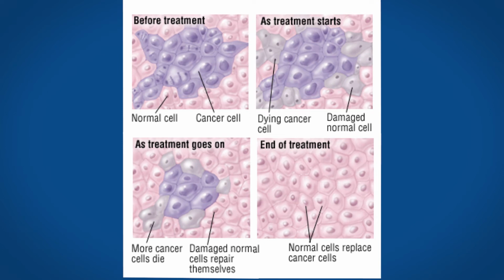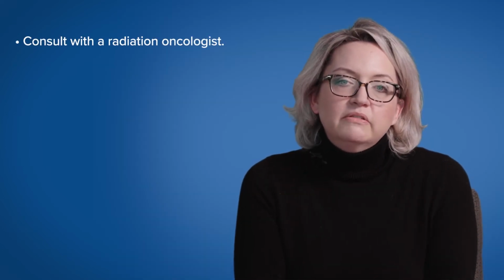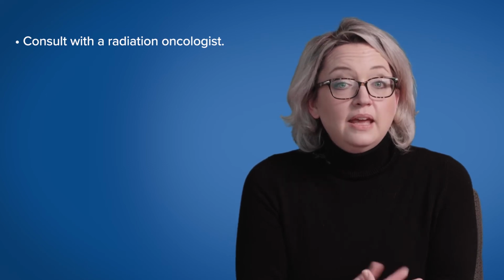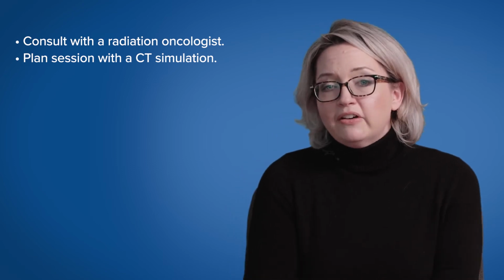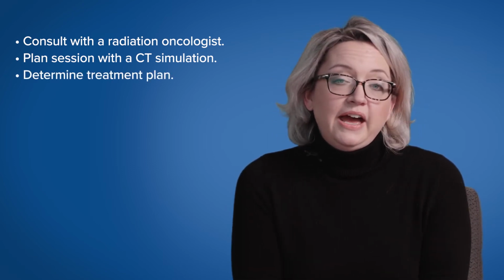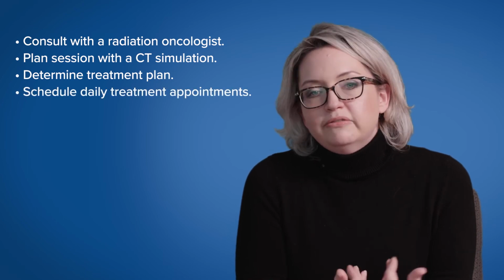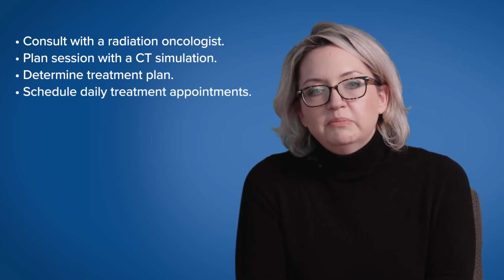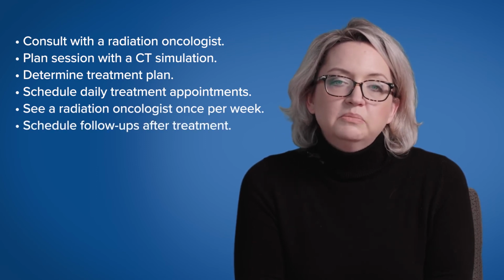If you're watching this video, you most likely have already met with one of our radiation oncologists, and they may have said that radiation therapy is appropriate for you. Now, if they have, then you may have already had your planning session, or you may be waiting to have that appointment. The planning session, for me, I think is the most important appointment that you have with us. It's really how we design that treatment plan for you.